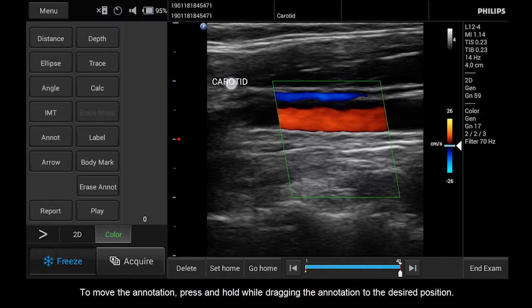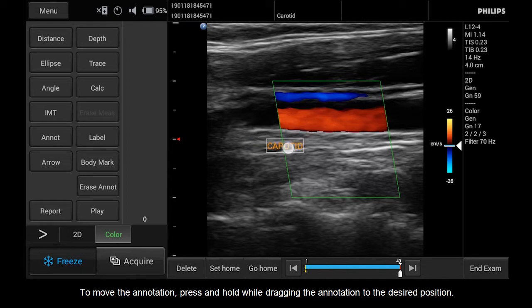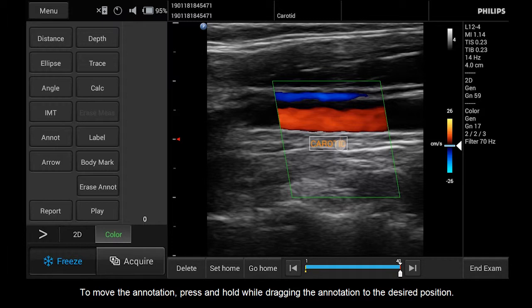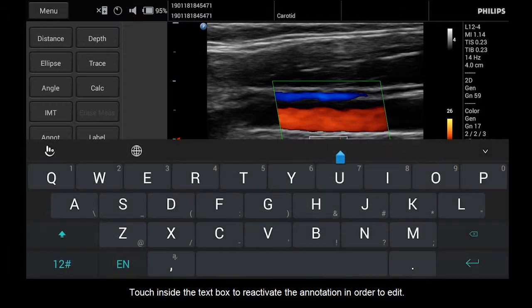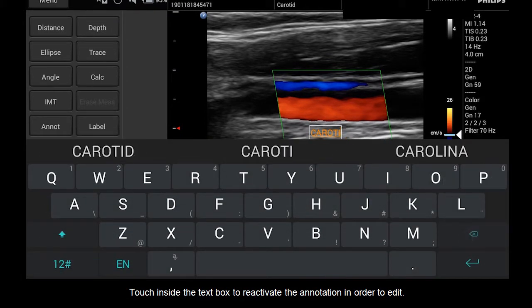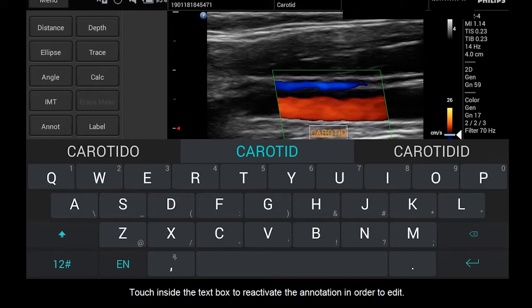To move the annotation, press and hold while dragging the annotation to the desired position. Touch inside the text box to reactivate the annotation in order to edit.